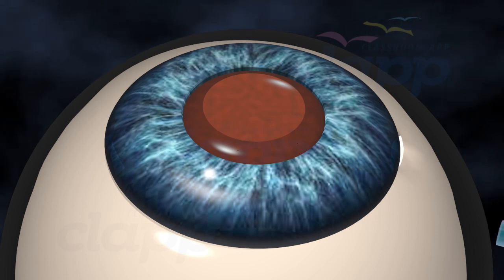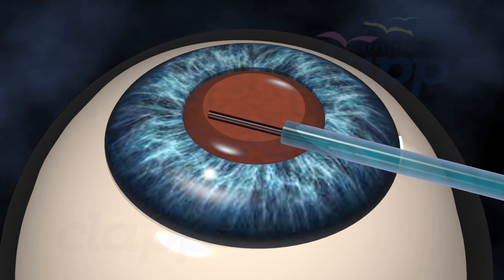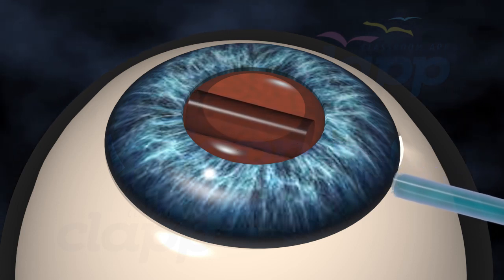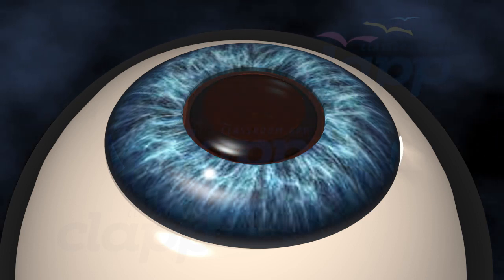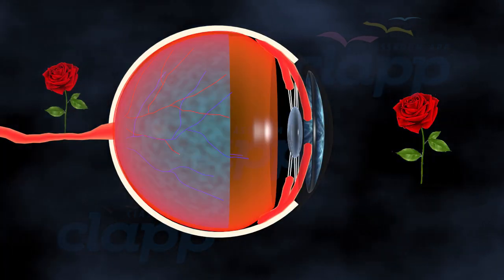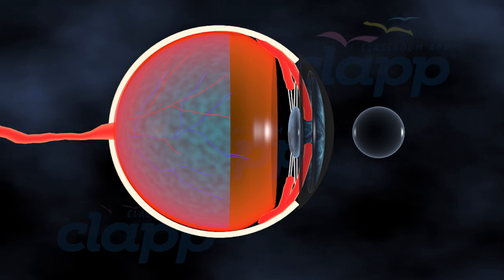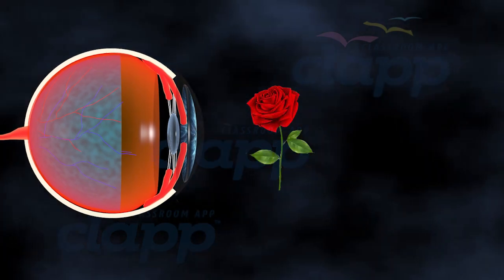After the cataract is removed, your surgeon will insert a clear artificial lens called an intraocular lens with an injector. The intraocular lens will unfold gently into the capsular bag. This implanted intraocular lens is fixated and centered in the eye, and the incision is self-sealing. This new lens will restore your vision like natural healthy lenses and often correct any existing refractive errors. Modern intraocular lenses like trifocal lenses will provide more convenience to patients in vision of near, intermediate, and far distant objects.